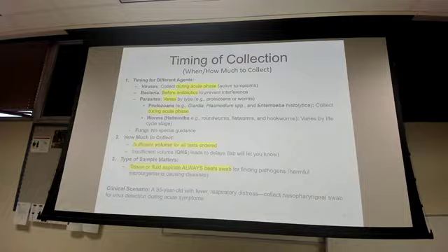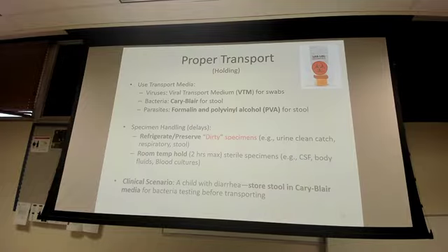Each lab will have specific guidance on how they want fungal specimens provided. Make sure you provide a sufficient volume for all the tests ordered, because you do not want a quantity not sufficient. You do not want to call your patient back in to collect more. They hate that, and we hate it too. For tissue or fluid aspirates, it's always preferred over swabs. So if you can get something in a cup for us, we would appreciate that. But if you have to do a swab, we'll do what we've got to do. We'll do our best to get you the result with what you provided.